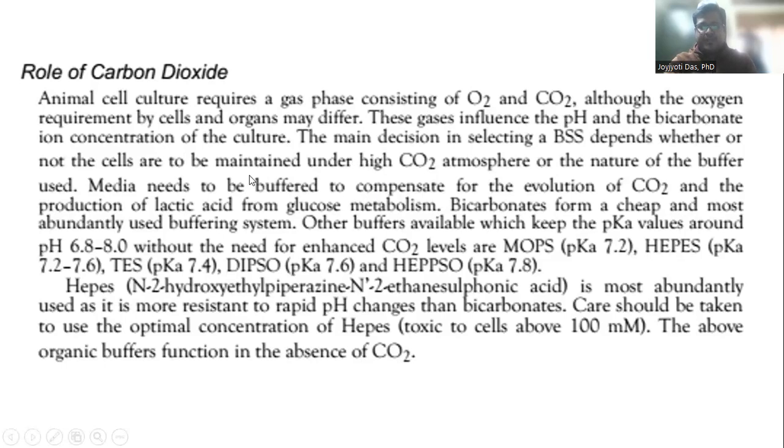The carbon dioxide that you supply through the carbon dioxide cylinder that we saw in one of our previous lectures, attached to the incubator, maintains the pH of the system by serving as a bicarbonate buffering system.